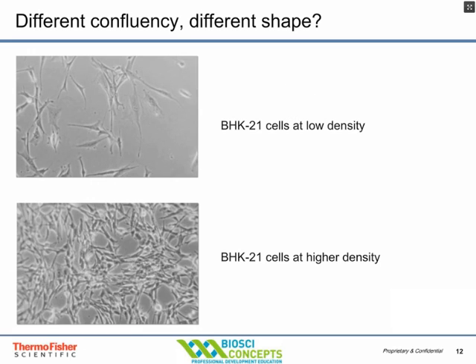Look at cells at different confluencies and different shapes. Here we can see some baby hamster kidney cells grown at low and high confluency — they look fairly different from one another. Low-density and high-density photographs are important. When your cells are growing at low density, that's the time to look morphologically for cell problems and contamination.